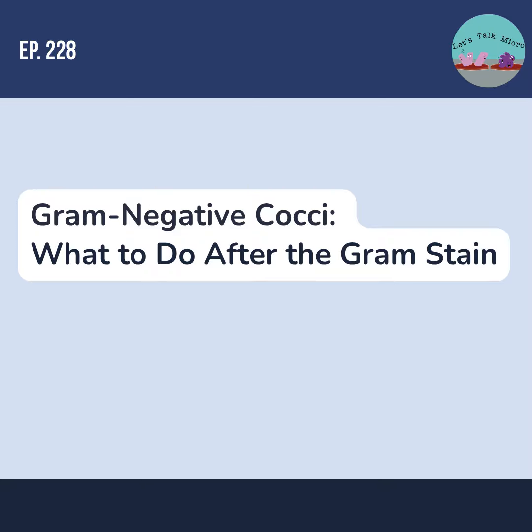So on the last episode, we started all the way from the basics, describing the gram stain and the morphology. We talked about the different genera and species of gram-negative cocci. We talked about decolorization issues and places where you typically see these species. And by that I mean that, of course, if you have a blood culture or a cerebrospinal fluid or a body fluid and you see something that you think is a gram-negative cocci, you definitely are going to be more afraid to report it.